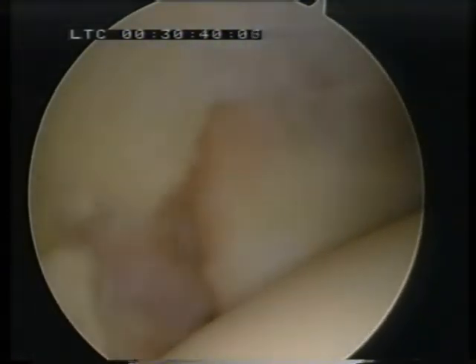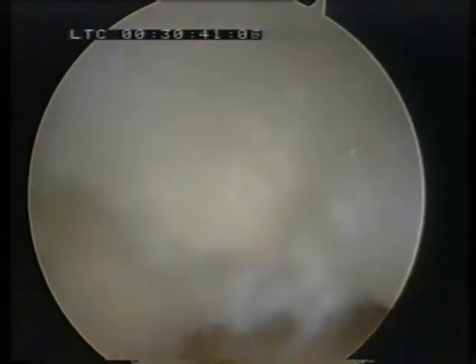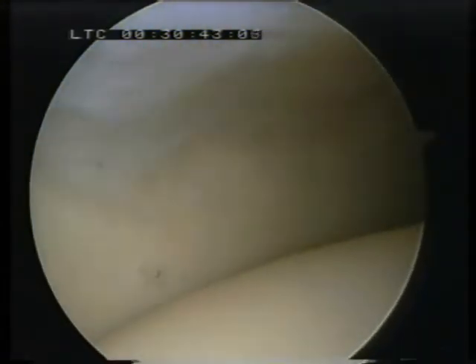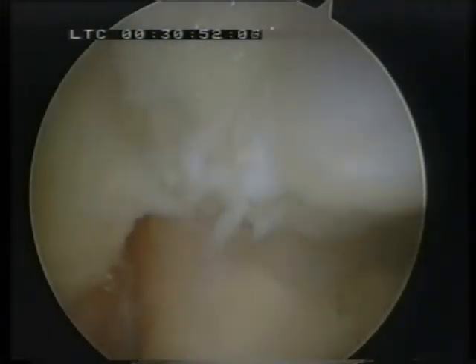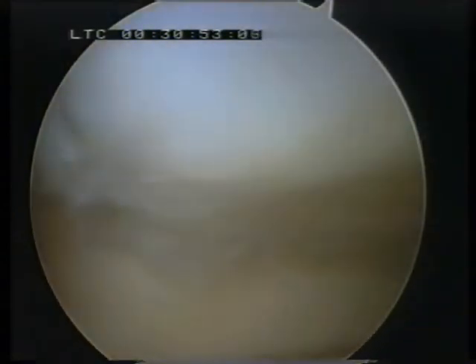At the end of the procedure, what we like to see is that the ankle looks nice and clear and free of debris. It's very important, particularly if you're removing anterior bony ankle impingement material, that you thoroughly clear out the ankle afterwards.